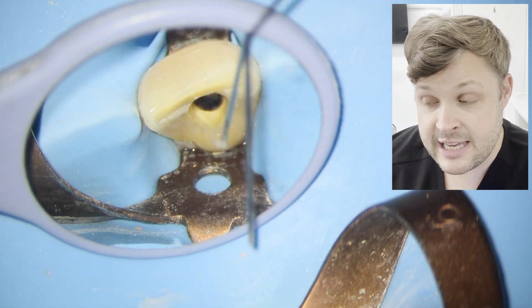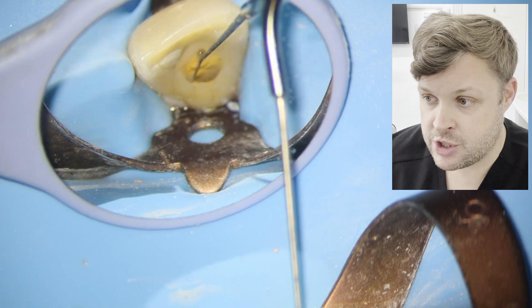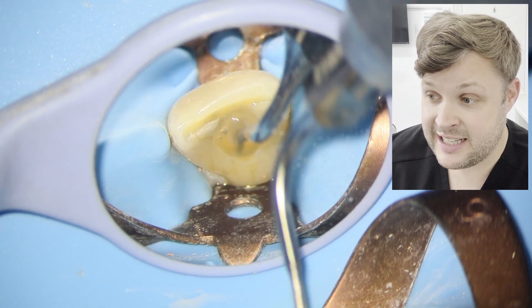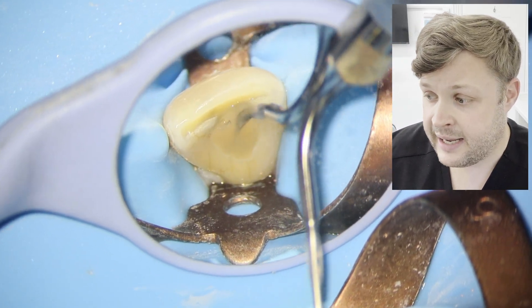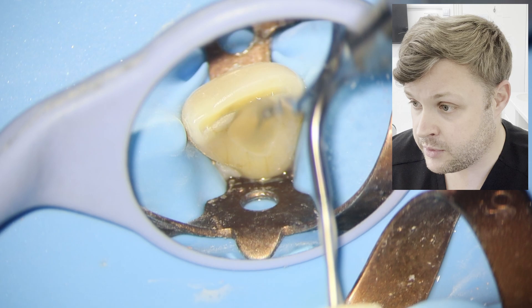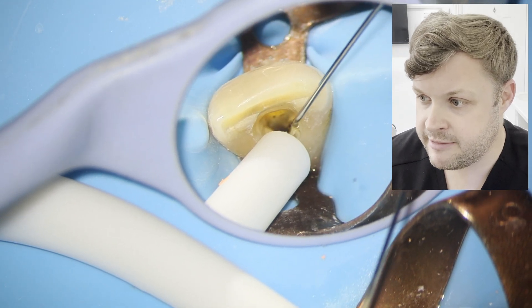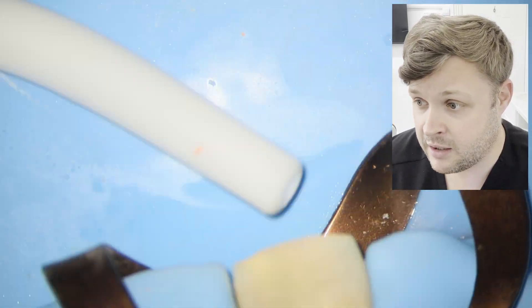My final irrigation protocol is 2% or 3% sodium hypochlorite, and then I ultrasonically activate the tooth. There is an argument that some re-route treatments need to be done over two appointments, but in this case the GP felt nice and clean with no obvious area of concern, and the patient preferred to be done in one treatment. When you activate it, all of the detritus in the irrigant comes out and it looks really, really nice and clean. I like to activate quite a lot.